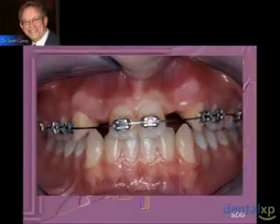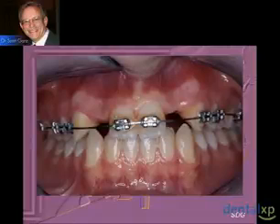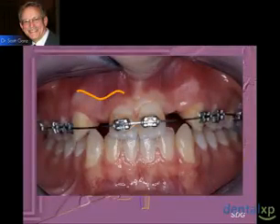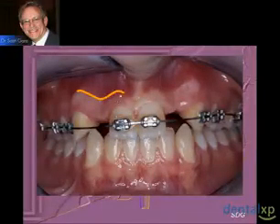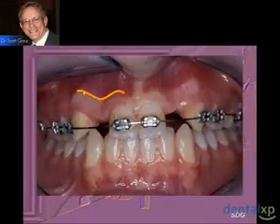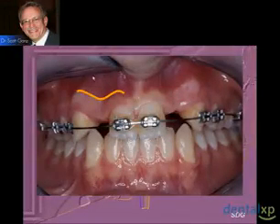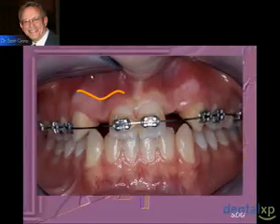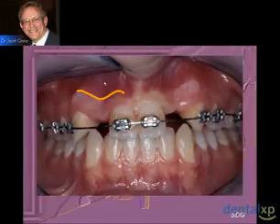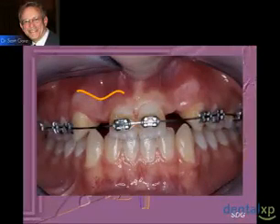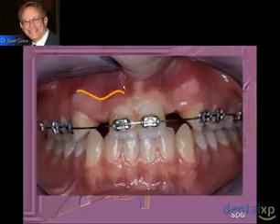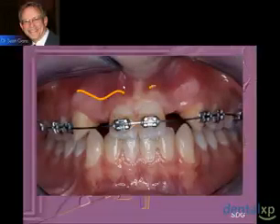We can see the demarcation between attached and unattached tissue, and when I describe this line here, it is a telltale sign of what's going on. In fact, if we use our fingers to palpate this area, we can actually feel the convergence of the canine root into the space required to place an implant.